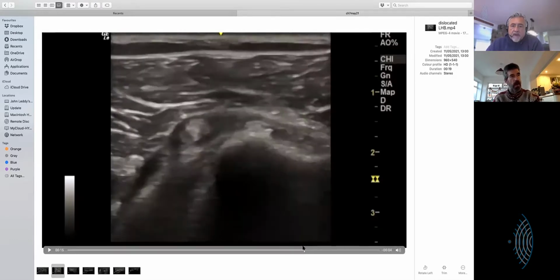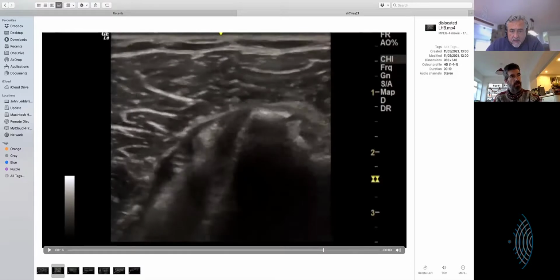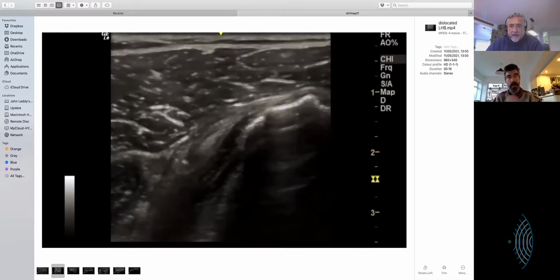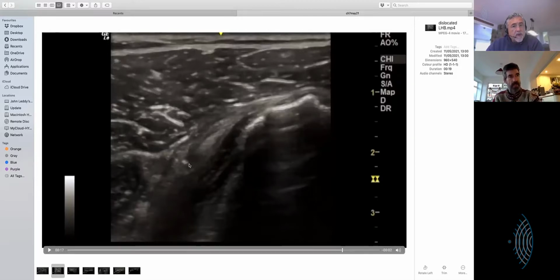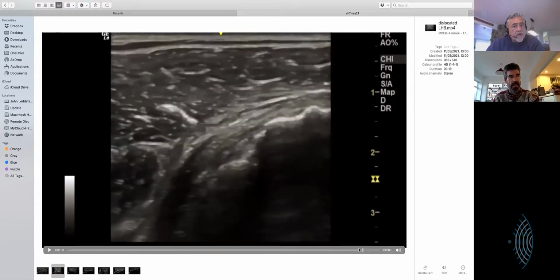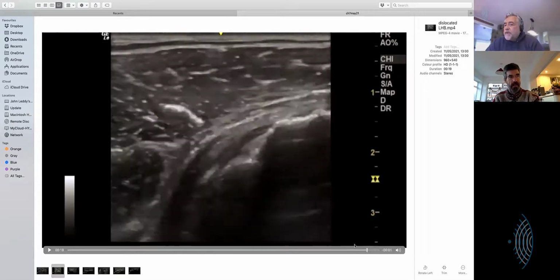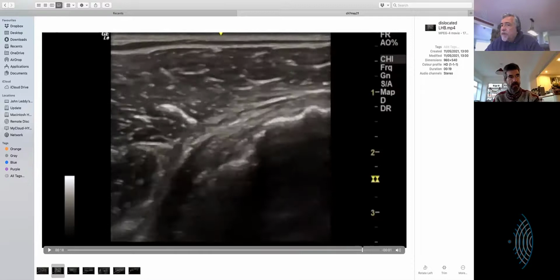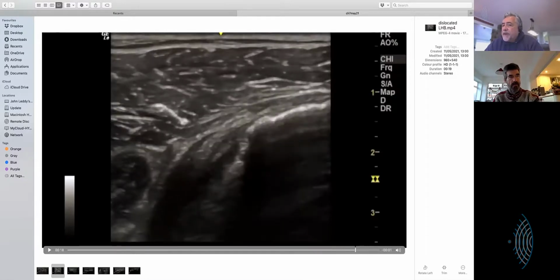Yeah. But as you go back, as you go through there, you know how you get meaty fibers. Yes. The lower part of subscap is meaty right up until the insertion. But as you go higher up, you should have tendons there. So if this biceps is dislocated, you should see those tendons running either over the top of it or underneath it. I want to clarify something with you, John. When you say deeper, are you saying profound deeper, or are you saying inferior deeper?